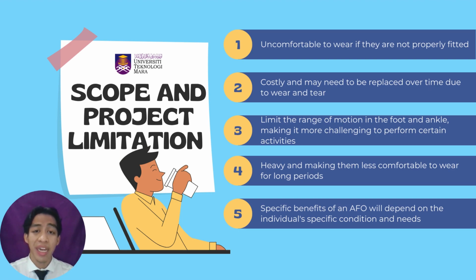Ankle foot orthosis can limit the range of motion in the foot and ankle, making it more challenging to perform certain activities such as running or climbing stairs. They can be heavy, making them less comfortable to wear for long periods. Ankle foot orthosis may not be effective for all individuals, and the specific benefits of an ankle foot orthosis will depend on the individual's specific condition and needs.